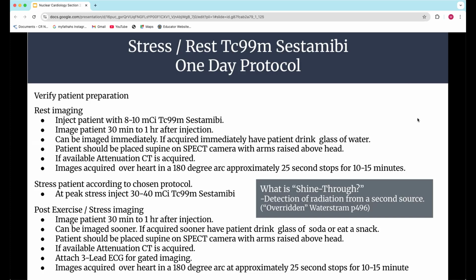Okay. All right. So think of that gallbladder, right? When you have your gallbladder, if you first start seeing it, maybe you can't quite see it well, you can take your window and brighten it up and make your gallbladder really bright, right? However, if you keep getting brighter and brighter, that liver sitting behind the gallbladder is eventually going to show through, and you can't see your gallbladder anymore, right? What that means is that your gallbladder has the most activity, but you don't see the liver underneath as well initially unless you brighten it way up.